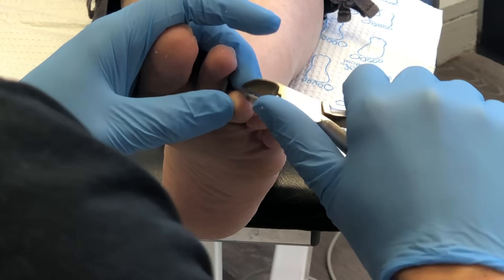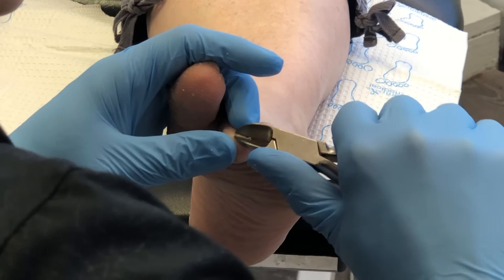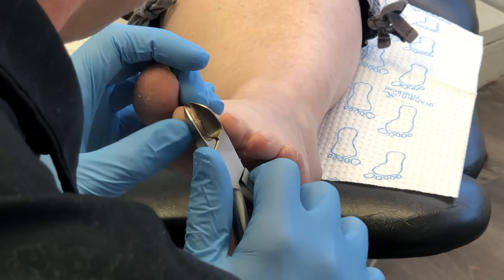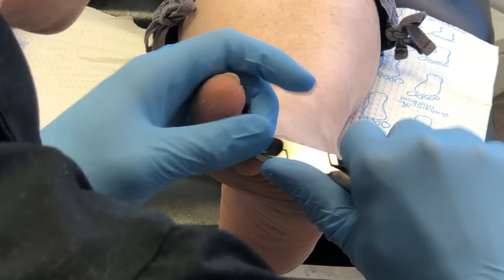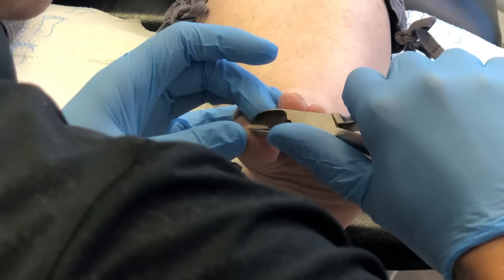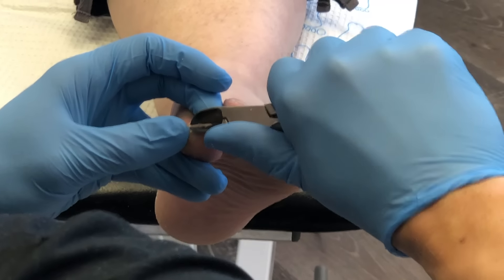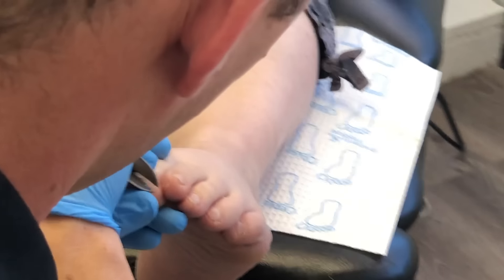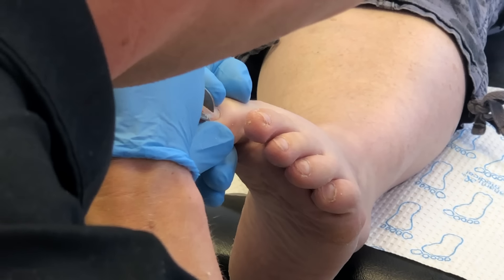Here we're trimming the toenails. One thing patients always say is that our nippers are quite intimidating — they do look big but that's just so it makes our job easier. The big toe is quite involuted and can grow into the corners, so you'll see we want to cut straight across and make sure that we're getting all of the nail on both sides, cutting straight across.